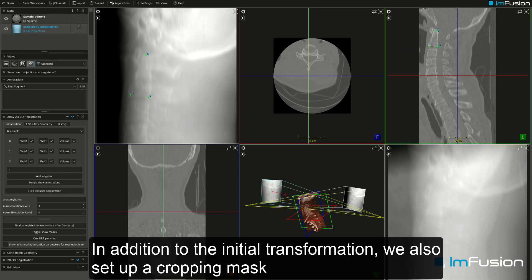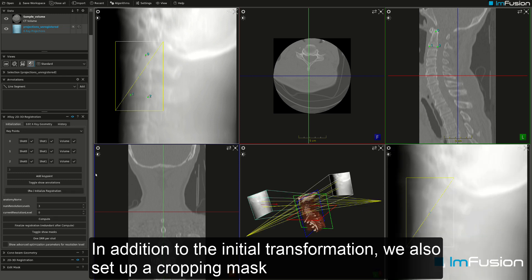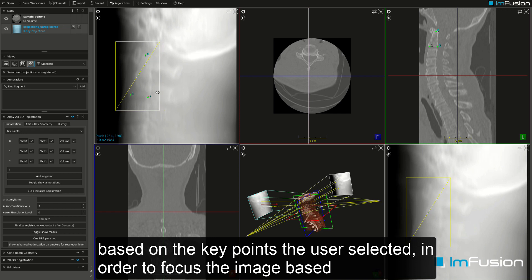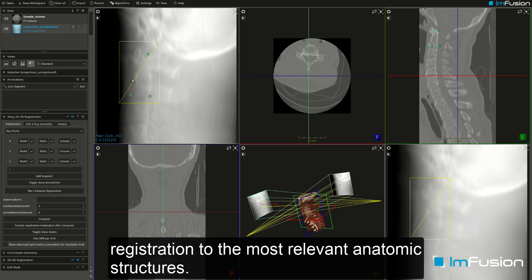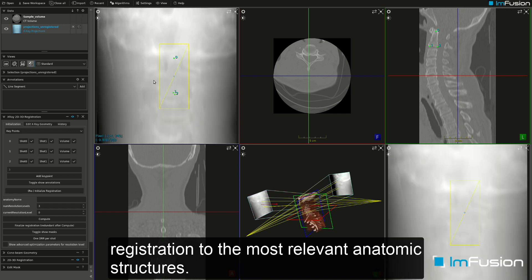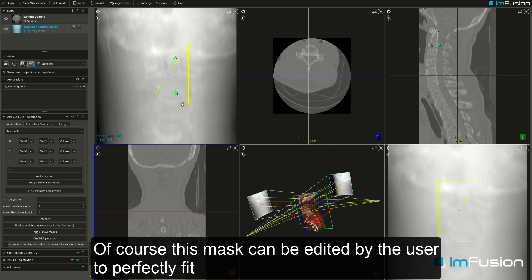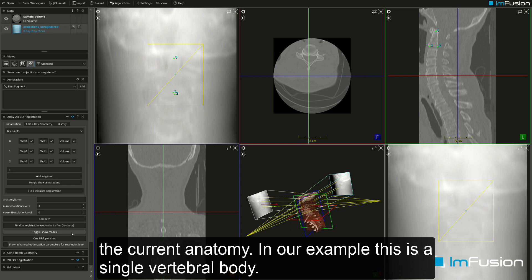In addition to the initial transformation, we also set up a cropping mask based on the key points selected, in order to focus the image-based registration on the most relevant anatomic structures. This mask can be edited by the user to perfectly fit the current anatomy — in our example, a single vertebral body.